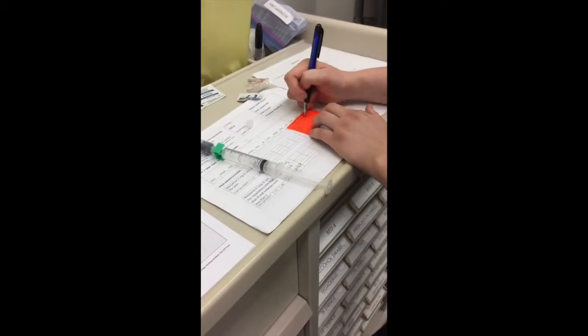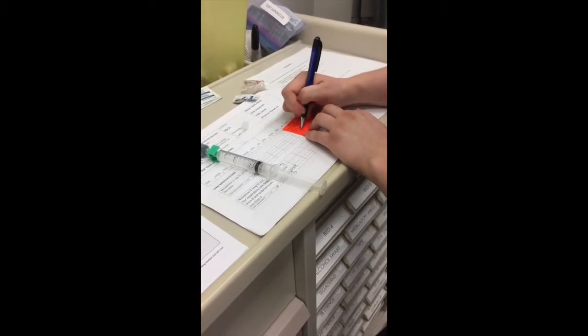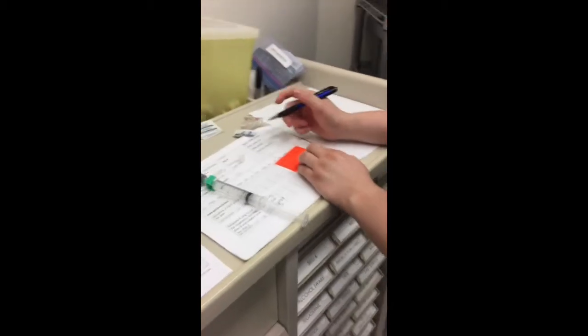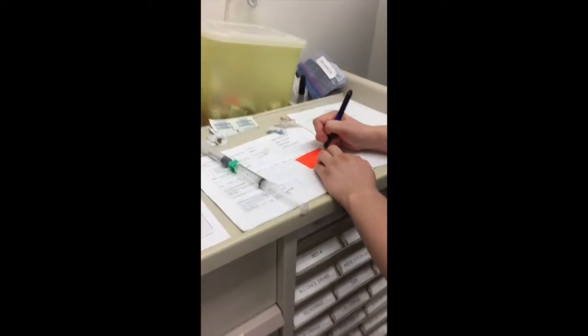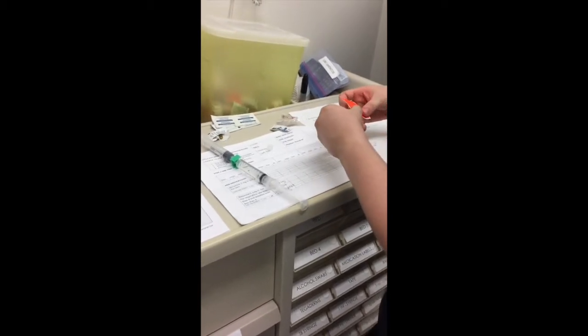And that's going down right here, and it's added by me, and then today is September 29th, 17, and it's going to be given at 10:45. Okay, so now I'm going to be attaching that onto my syringe, making sure.